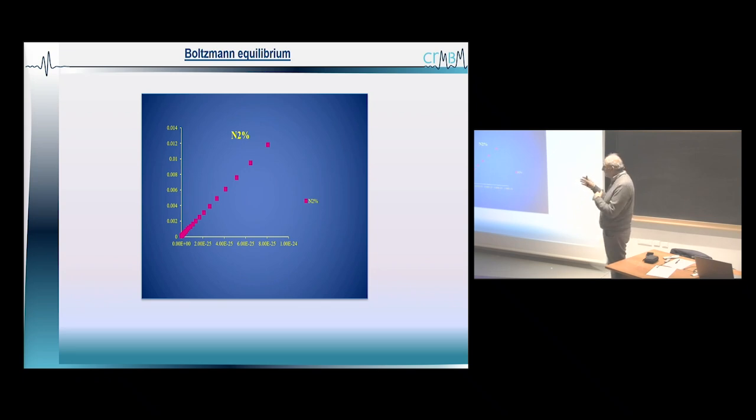But for instance, if you change the nuclei, let's go to phosphorus, you've got much fewer molecules of phosphorus than molecules of water in the body. So it would be very difficult to get images of phosphorus, and you won't be able to have all the anatomical details you can have on an image of a brain, for instance. It's just because the amount of water molecules is very high, sorry. But still the difference is very small.